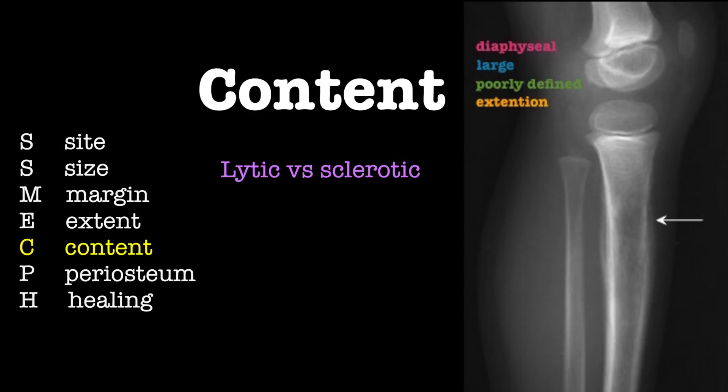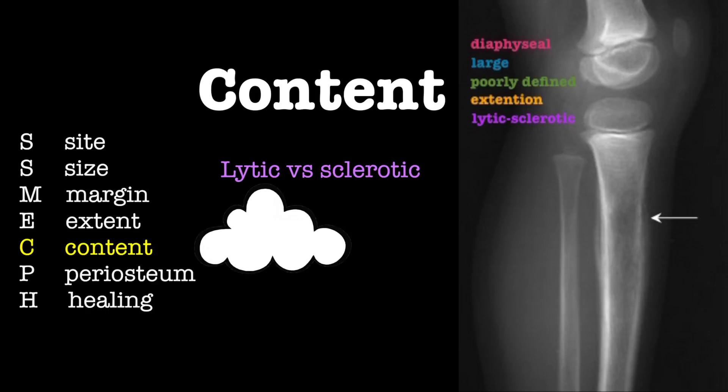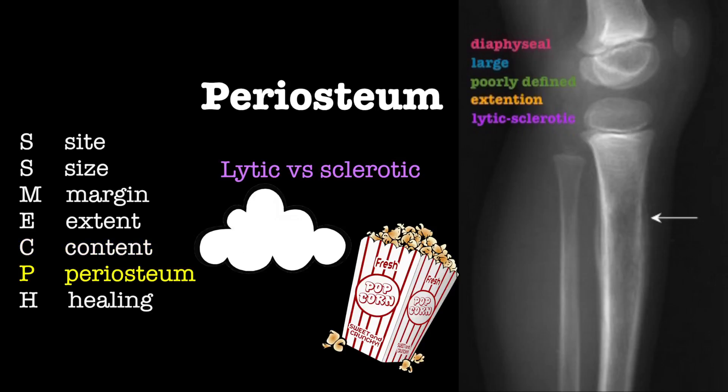This lesion has both a lytic and sclerotic appearance. Also look for a cloudy appearance of an osteoid matrix, seen in osteosarcoma, and a popcorn appearance of a chondroid matrix, seen in chondrosarcoma.